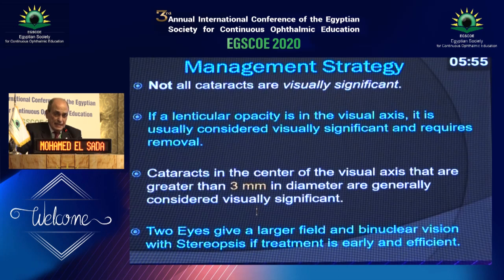قالوا 3 ملي، 3 ملي انت تقدر تعملها in proportionate with the size of the iris. ليه؟ ايه حكمة الناس اللي they operate اليونيلاترال كاتاراكت؟ انا لما كنت نائب كان استاذي يقول لي اليونيلاترال كاتاراكت ده inoperable. ليه الناس دي بتقول كده؟ وايه وجهة النظر المضادة؟ وجهة النظر المضادة ان two eyes will give you a larger field مثلا. نمرة 2، if you are successful in the treatment and management of this case, you did a good surgery, you did a good post-operative management، وبالتالي you will end up with a fascinating advantage اللي ربنا اداهولنا اللي هو الباينوكولار ستيريوبسيس. binocular vision and stereopsis دي خدمة إلهية اداها للإنسان.